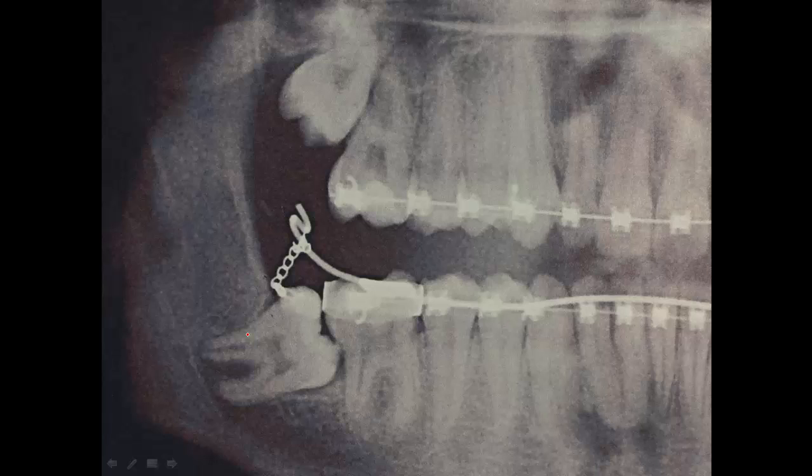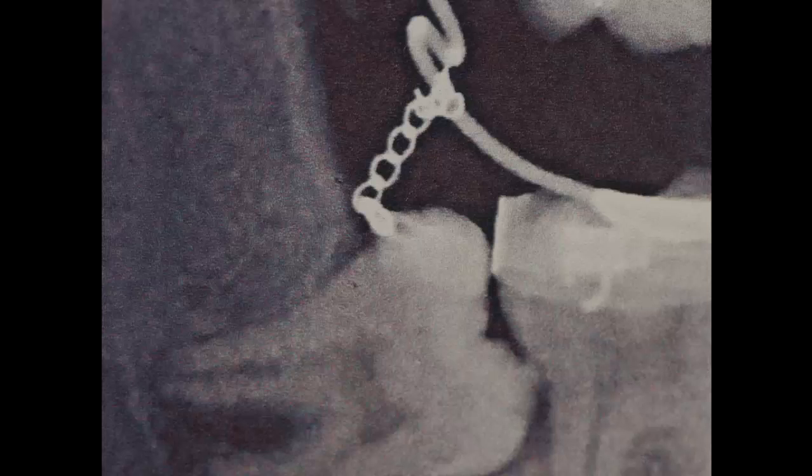So there's all kinds of other ways that we'll try to push this tooth backward, but the way that we're showing you is, to my way, the very best way to do it. If I could find a better way than that, I would certainly have taught it over the years, rather than the way that I'm teaching people to do this. So that is a mechanical situation where somebody just didn't understand how the tooth moves. And they could put something like that on it, you see, and put a spring on it and come out, and it would just raise that tooth right out of that place without any messing around about it.